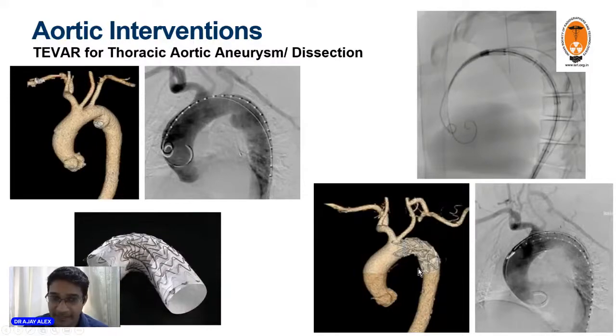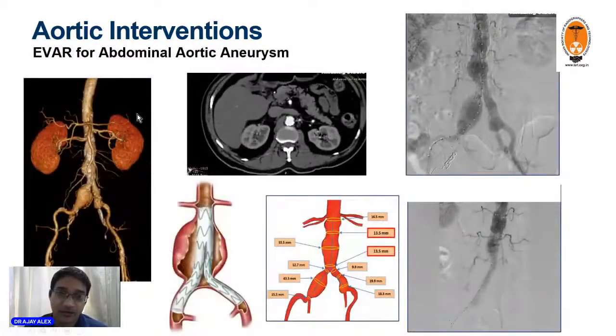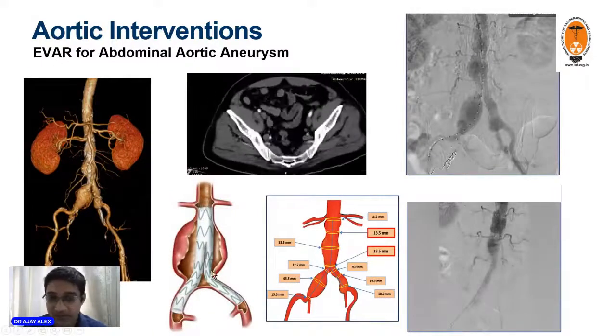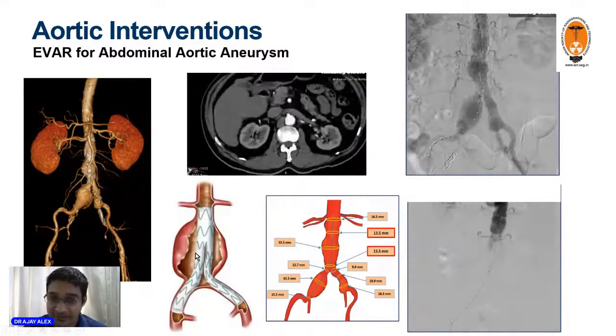be filling. The same treatment is also available now for abdominal aortic aneurysms as well, the term being called as an EVAR. In these, you have bilimbs. There are two limbs for the distal end in order to being placed into both the iliac vessels as well.